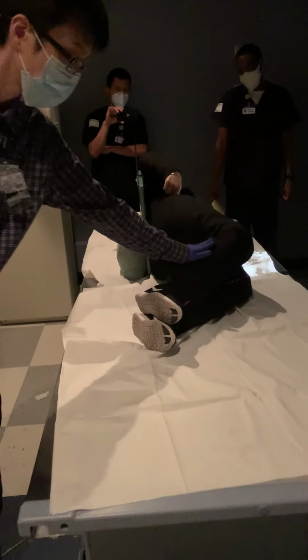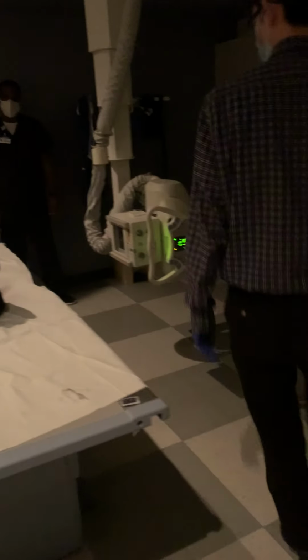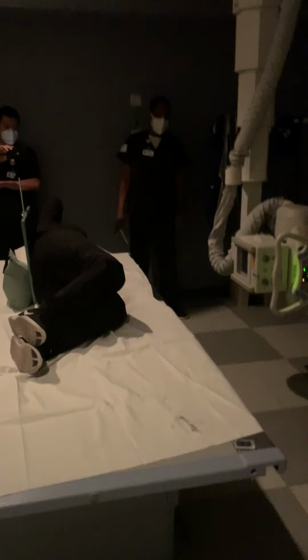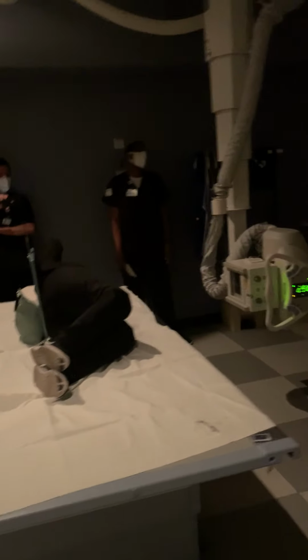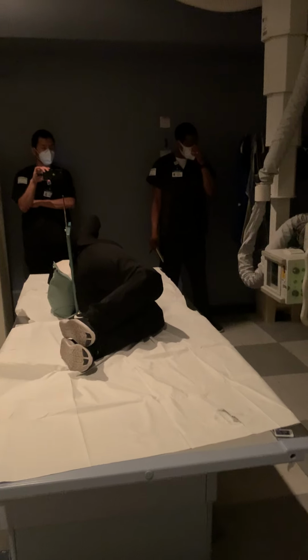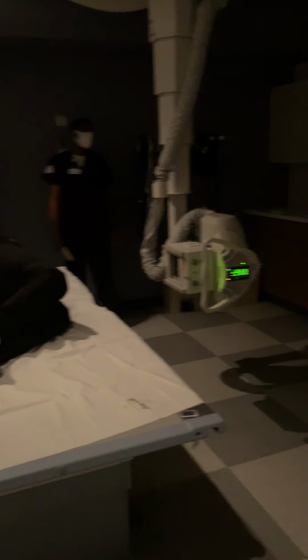Once again, legs are bent on top of each other. All right, and bring both hands up. Good. So, unlike the chest lateral decubitus, we don't need to start with an arm down because we're not looking for light above the shoulders, we're not looking for axilla or nipple line in terms of positioning. So just start both arms out.